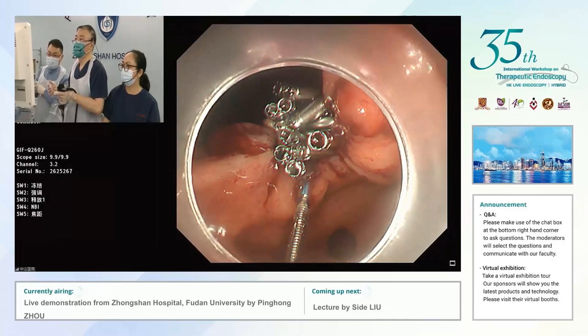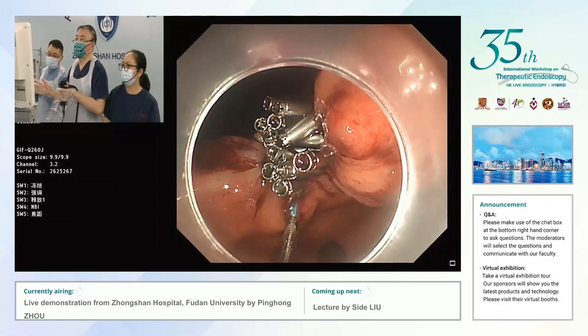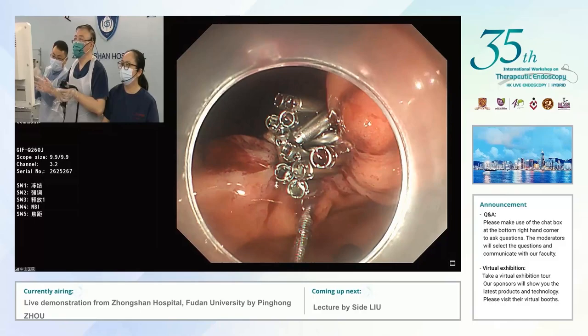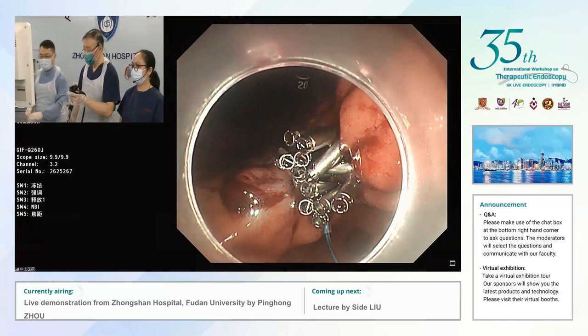One, two, three, four — looks like someone's birthday candles. Release. That's very nice.